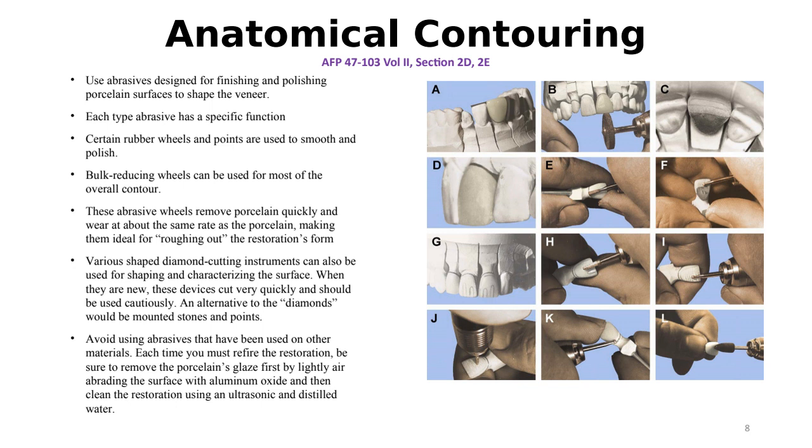Also, sometimes as beginners in this profession, we tend to overdo some of this stuff, right? Because you think, oh, there is a groove in there, I gotta go in there. Excavate, make it deeper. And then it looks like, wow, the patient has a cavity in there, right? So always subtle, right? Everything is very subtle. So do a little bit.